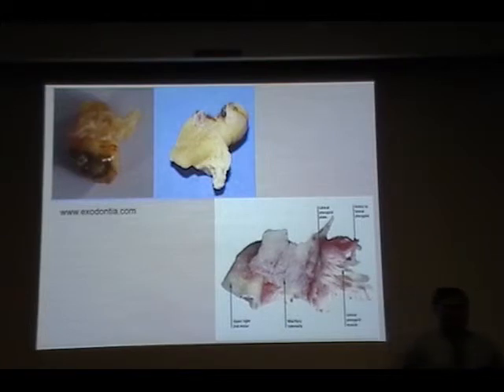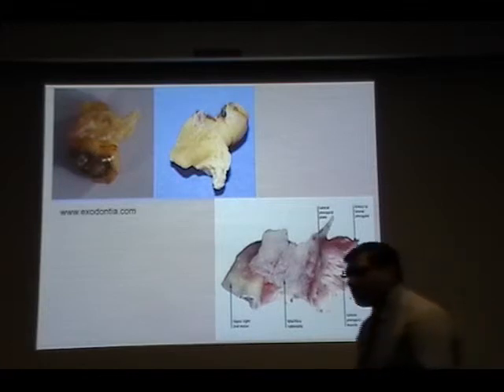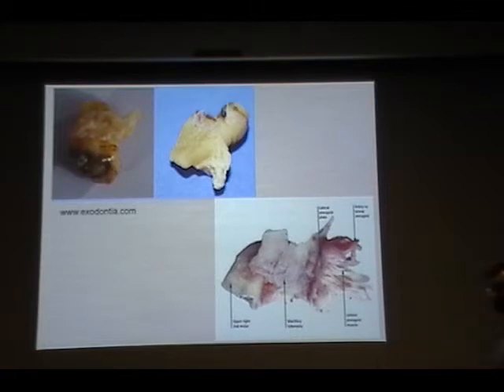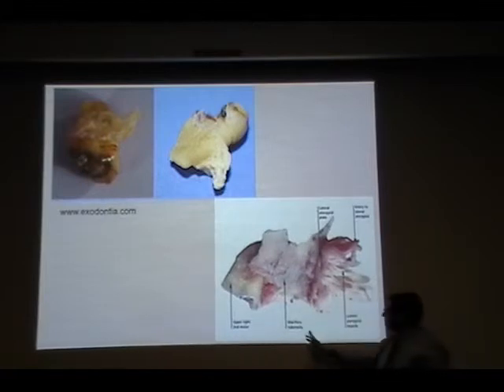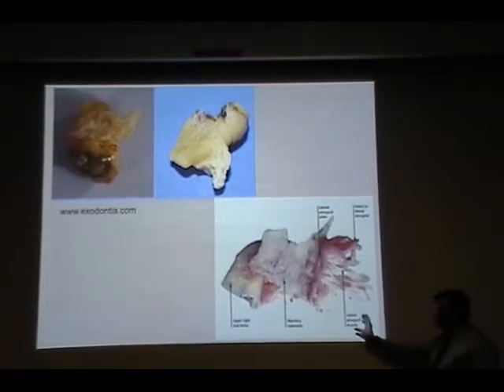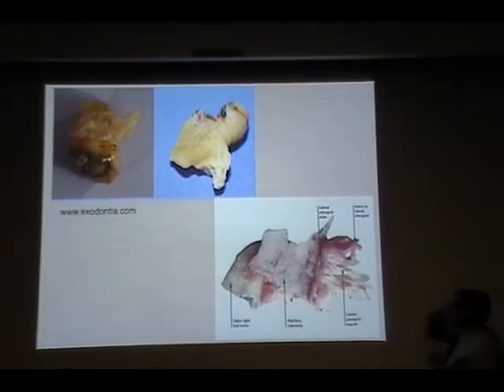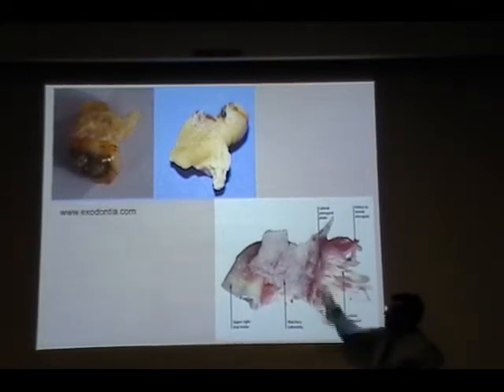When you are trying to extract a tooth, there is a possibility that the pterygoid plate may fracture. So you have to be cautious, and that's why we are trying to learn how a pterygoid plate looks. In this particular example, they not only broke the maxillary tuberosity, but part of the muscle has come up, that's the lateral pterygoid muscle, and the lateral pterygoid plate.